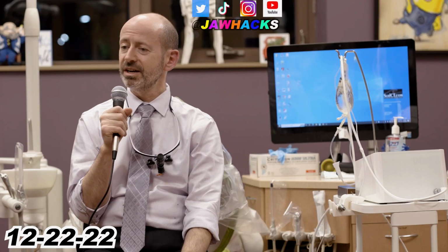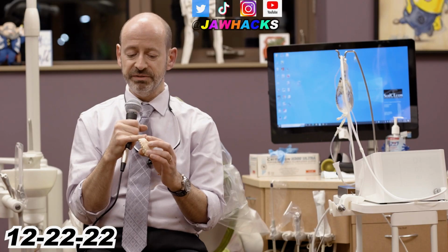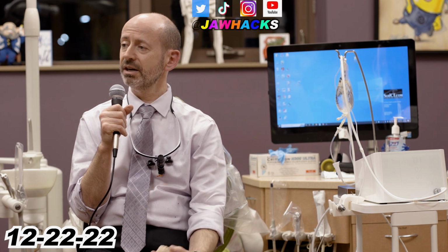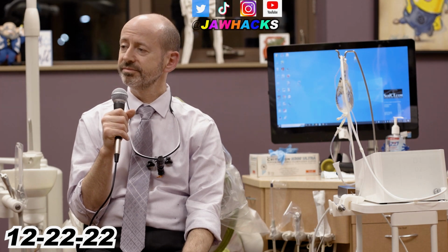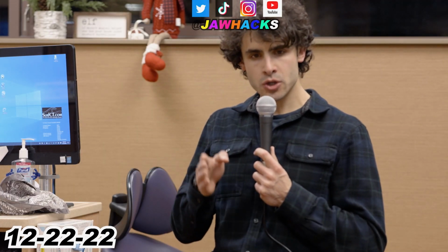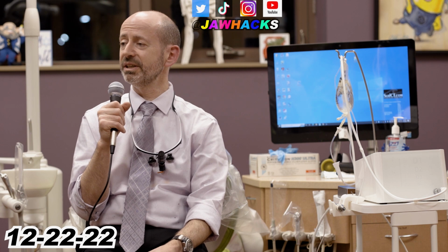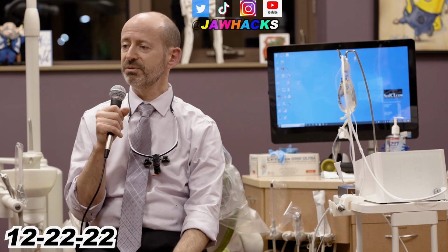Why not? First of all, there's not a lot of blood vessels where we cut, at the roof of the mouth. But even here, it probably has something to do with the ultrasonic nature of the PIEZO tome that it doesn't bleed. So the knife itself doesn't actually cut because it's sharp. Does it cut because it vibrates? It's a vibration. Is it a heat or is it a vibration? No, just vibration, no heat. I mean, it gets hot because of the vibration, but there is a cooling mechanism that comes with it. So we don't want it to get hot.